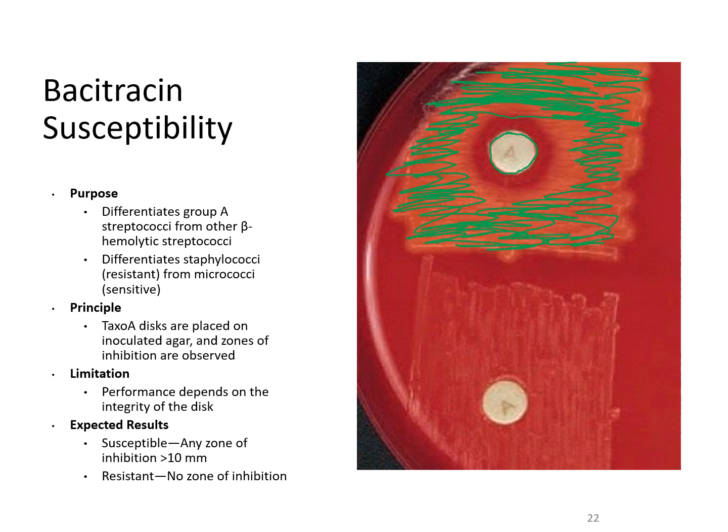What will happen is that the antibiotic from this disc will leach out into the agar. As it leaches out, if the organism is susceptible, it will not grow up to a certain point where that antibiotic starts to dilute out. If it does not grow, it's considered inhibited.